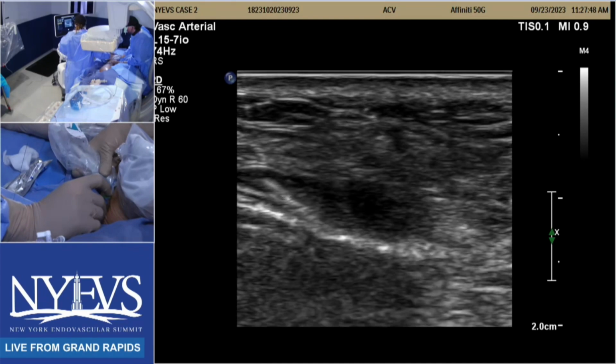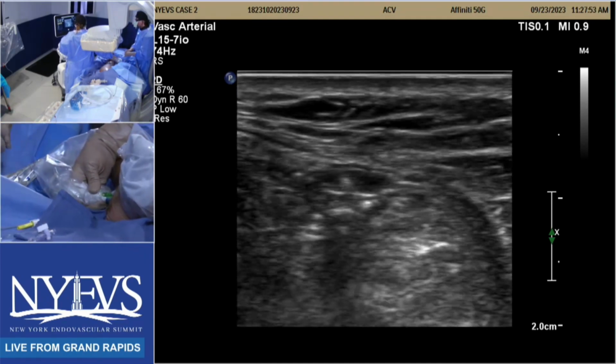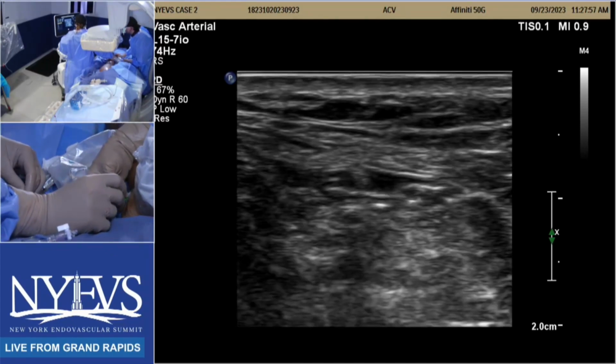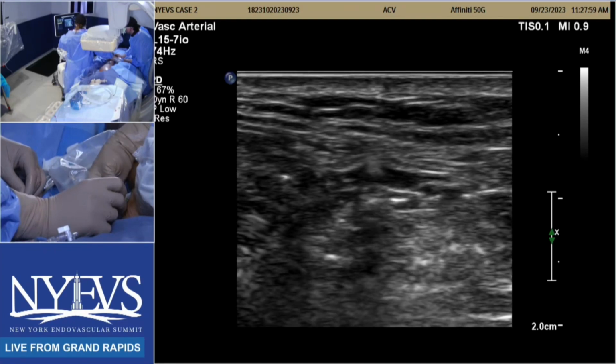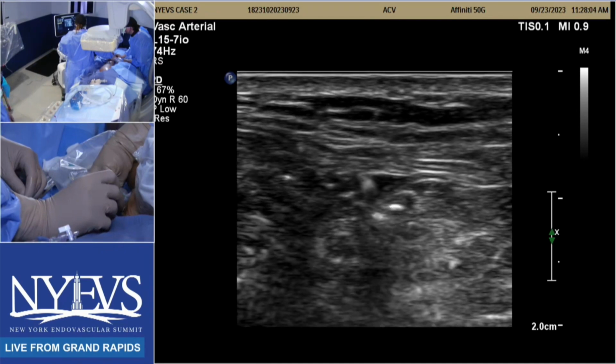I would think vein mapping, you said yourself, it's a young patient. I don't think any of this is wrong because this is not going to burn any bridge. Worst case scenario, you won't get in, and as long as you don't aggressively ruin that single vessel runoff, you haven't done anything wrong. Christian, Eric, anything different than what you've heard already?